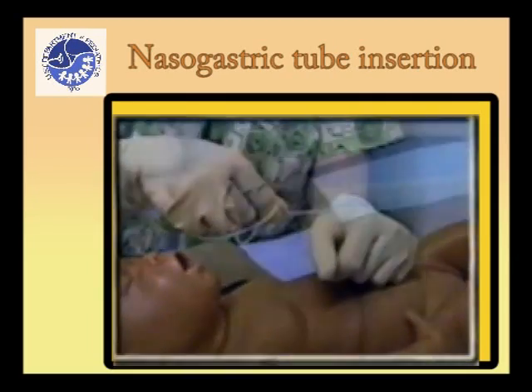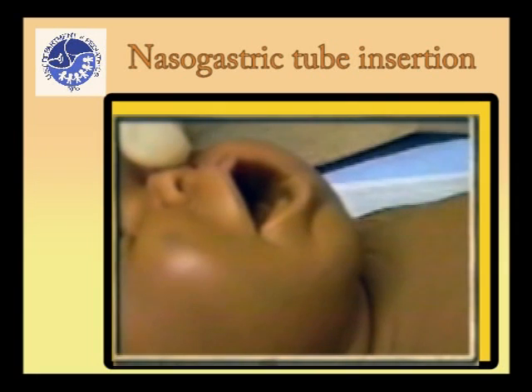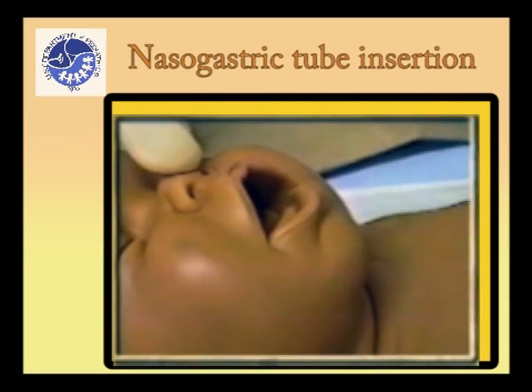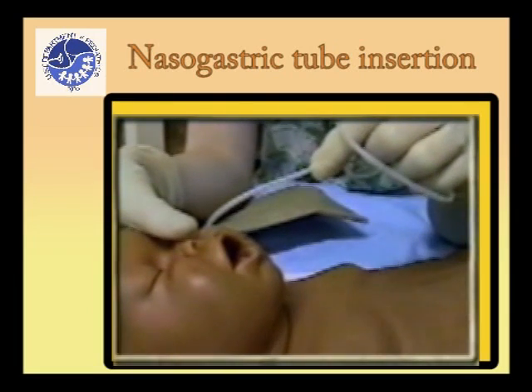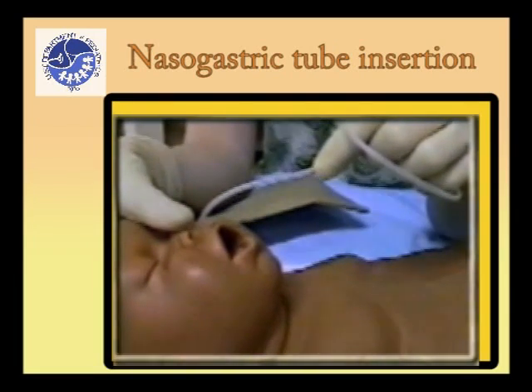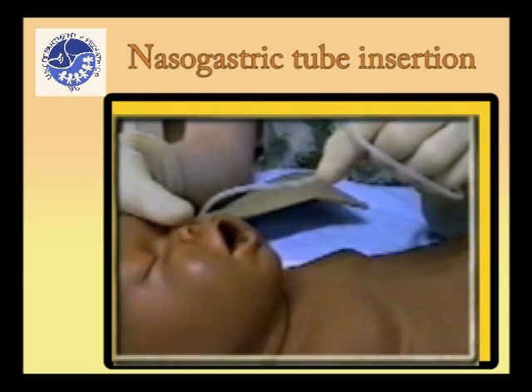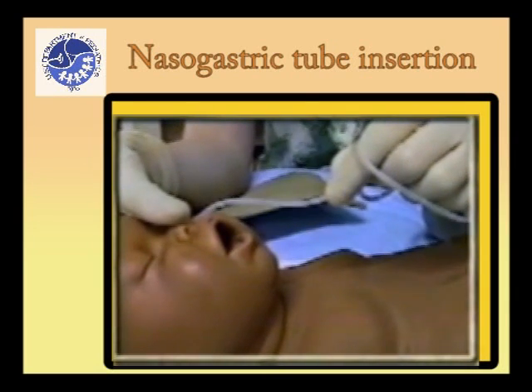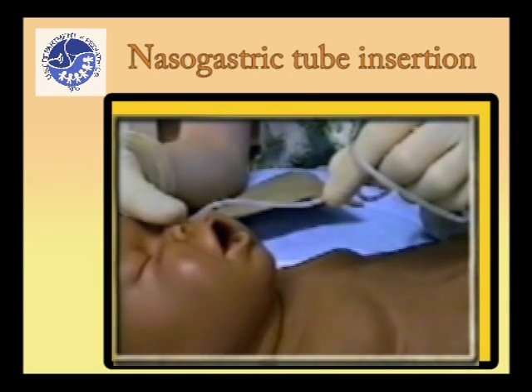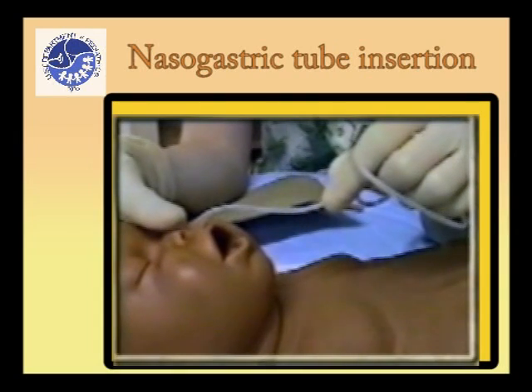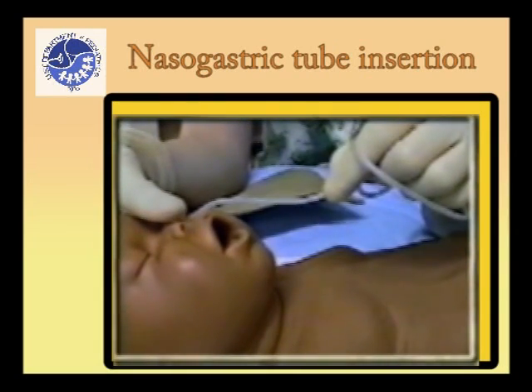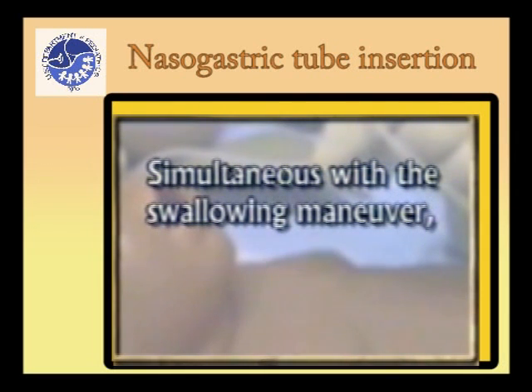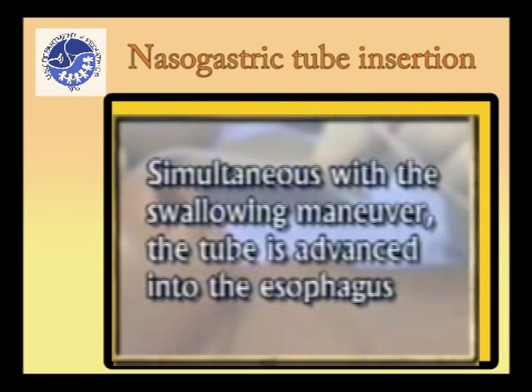The tip of the nose is pressed upward with the operator's free thumb. This enlarges the external nasal opening. Slide the tube into the nostril along the base of the nose, aiming toward the occiput. When the tube reaches the pharynx, ask the patient to swallow or offer him water to drink with a straw. Simultaneous with the swallowing maneuver, the tube is advanced into the esophagus.